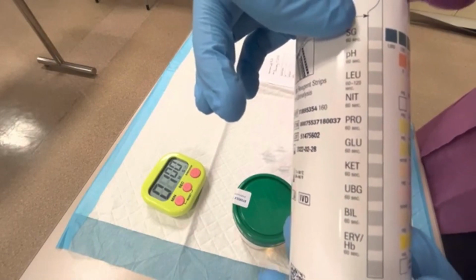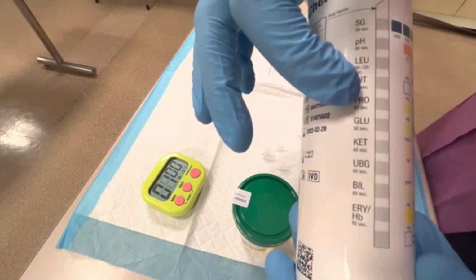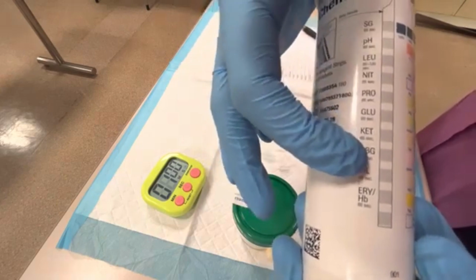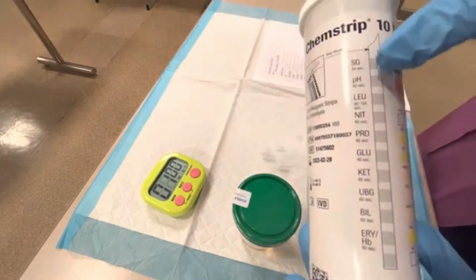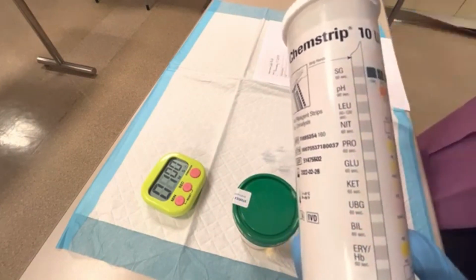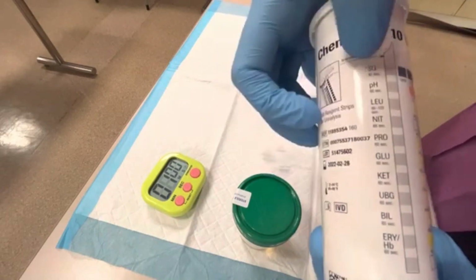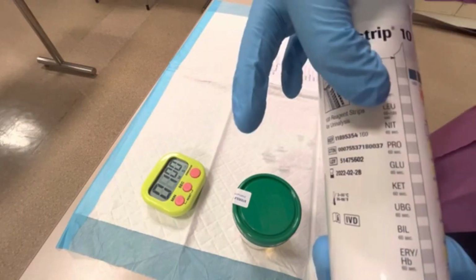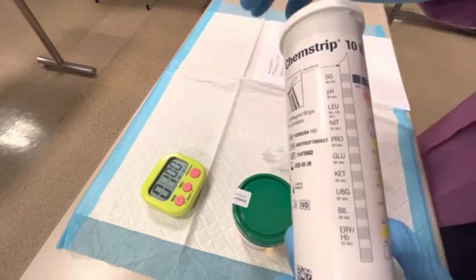So there's specific gravity, pH, leukocyte esterase, nitrite, protein, glucose, ketones, urobilinogen, bilirubin, and erythrocytes, which are red blood cells. And also on here, it tells you the specific timing that is required. So once you dip the urine, you have to read it at this particular second. Most of these are 60 seconds. The only one that's different for this specific brand is leukocyte esterase, that is 60 to 120 seconds.